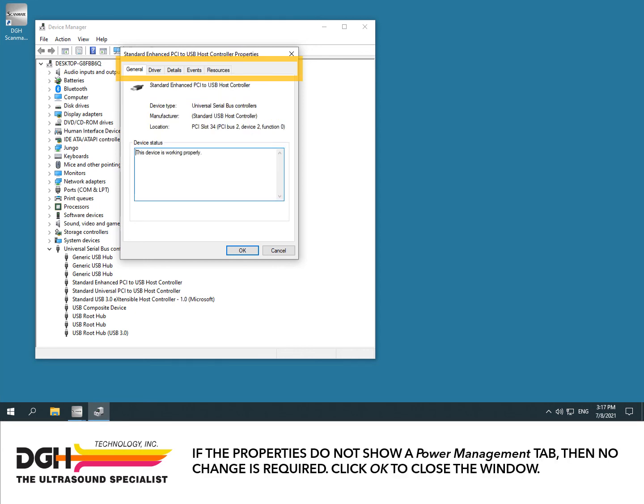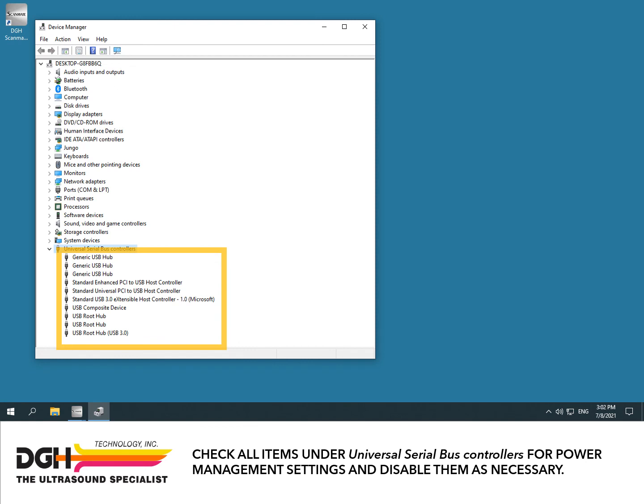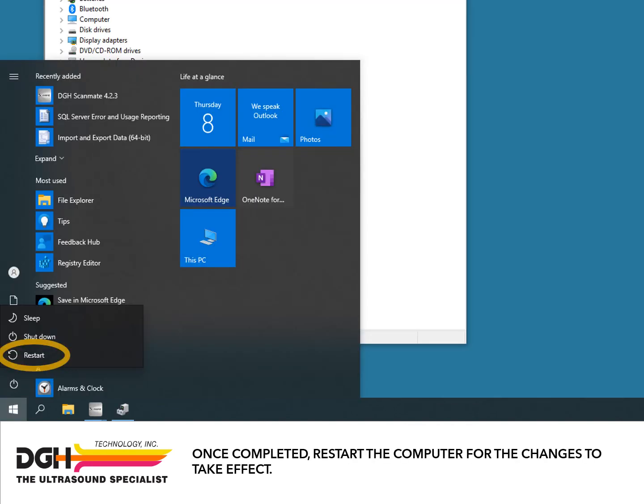If the properties do not show a Power Management tab, then no change is required. Click OK to close the window. Check all items under Universal Serial Bus Controllers for power management settings and disable them as necessary. Once completed, restart the computer for the changes to take effect.